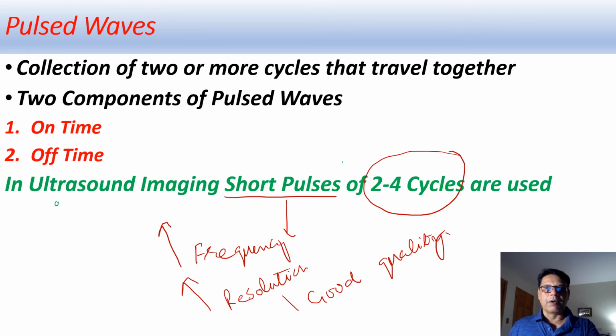Once again, you need to remember that high frequency, short pulses trade off between penetration. These short pulses have high resolution but low penetration.